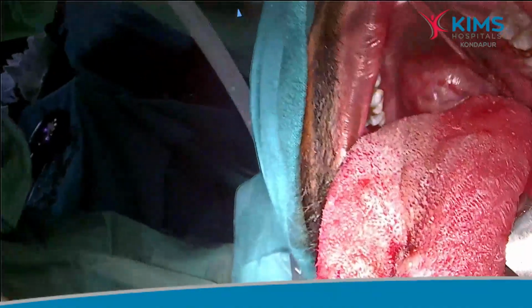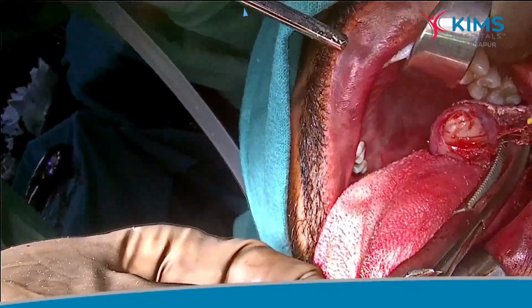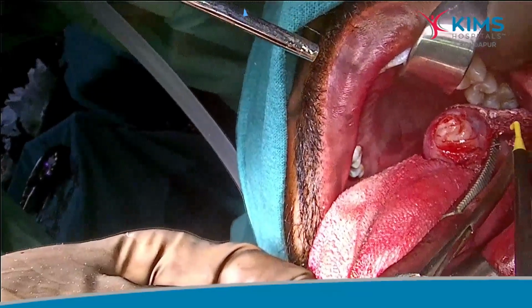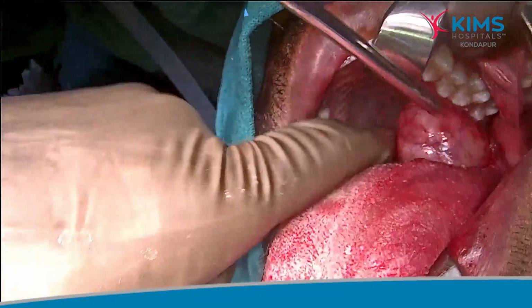And the upper flap is being separated now, the superficial flap. The superficial flap here, if you can notice, has been preserved so that it can be used for primary suturing.